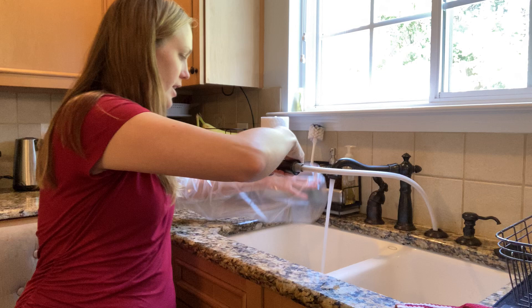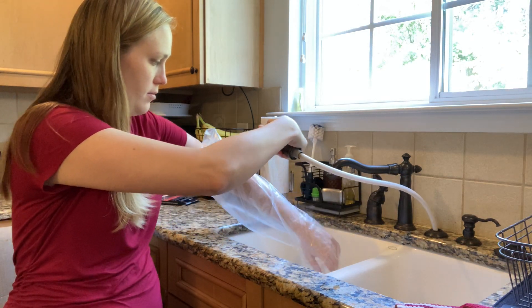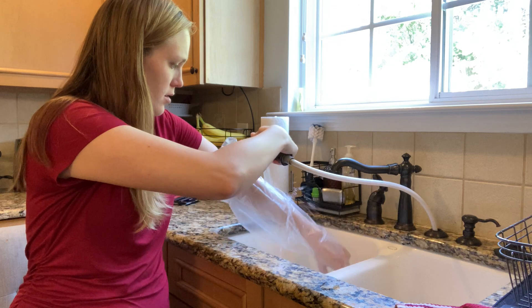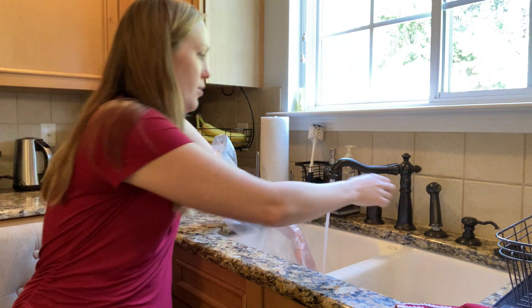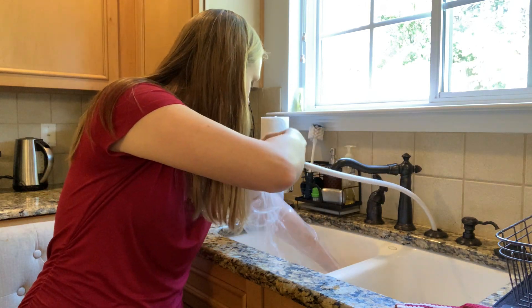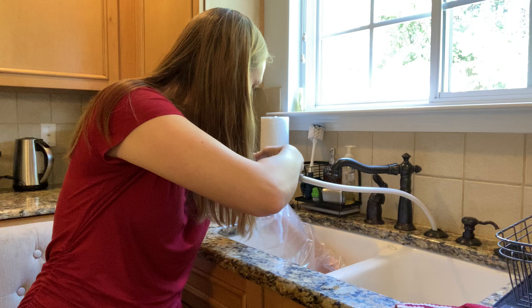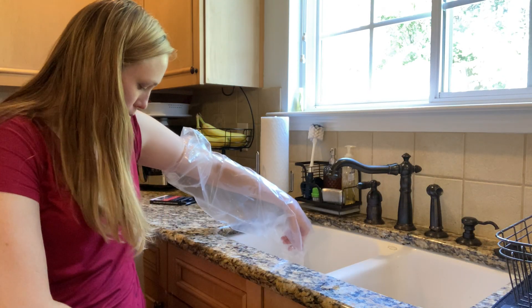I'm not super worried that it's not going to keep water out of the bottom because there's no place for water to get in there. Yeah, it's bouncing right off. So let me roll my sleeve up and we're going to see if water can get in the top — if it was running down my arm in the shower. Getting in the splash zone over here.